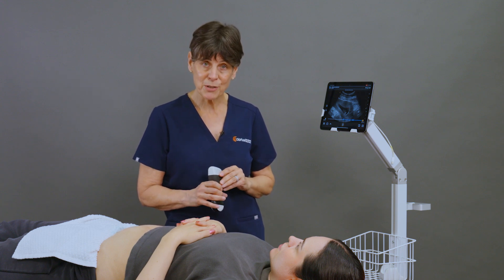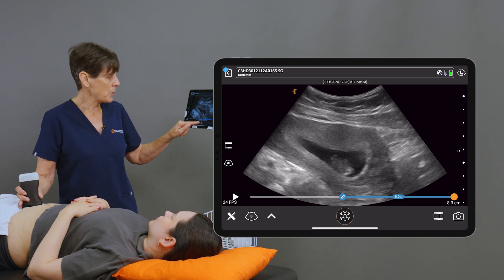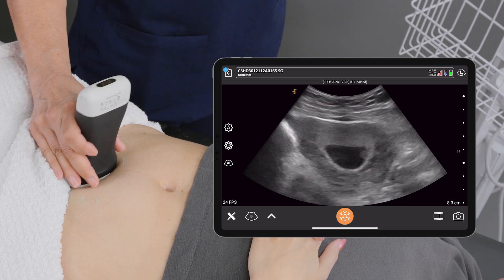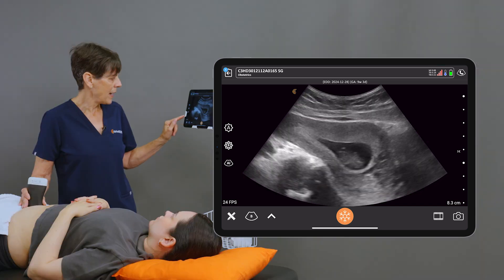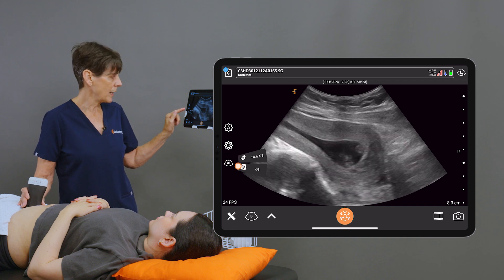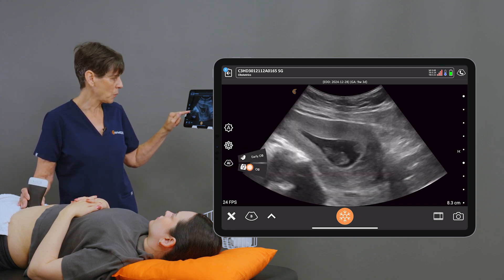I have a first trimester model here. I'm using the C3 scanner in the obstetrics preset and we're just going to locate the region of the baby. It doesn't have to be perfect, and to activate the OB AI I'm going to click the AI icon and let the system know that we're doing an early OB so that it knows the measurement that we're going to be doing.